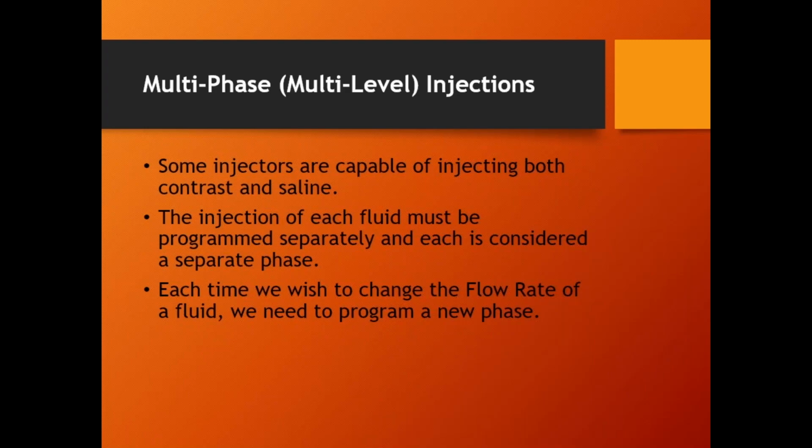So that is a multi-phase or a multi-level, the Probus, the one angio injector on the planet. It refers to them as levels, but literally every other manufacturer and model calls them phases. But that's why you would do a multi-phase injection.